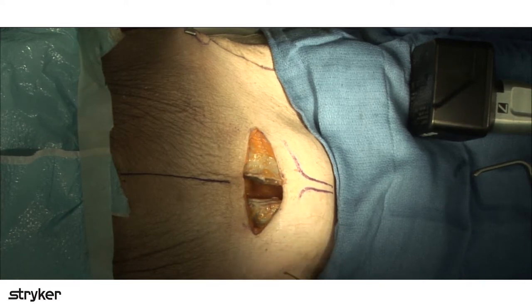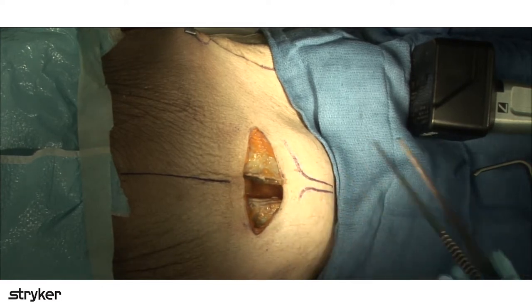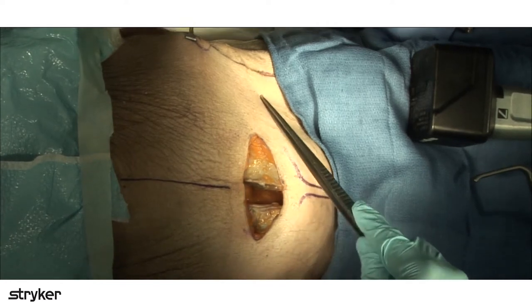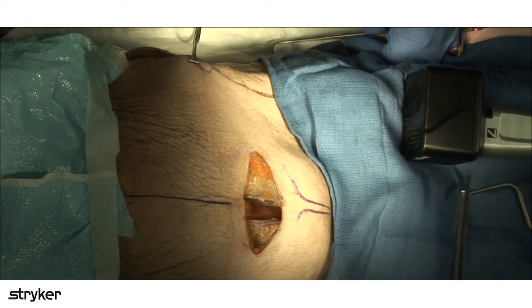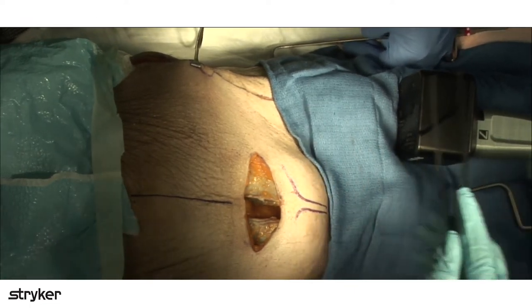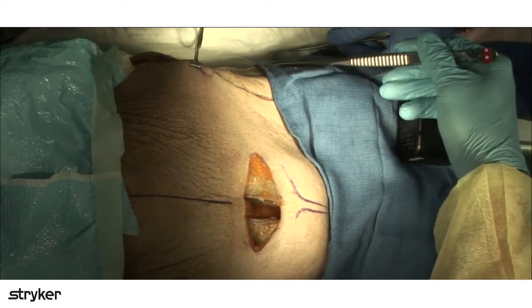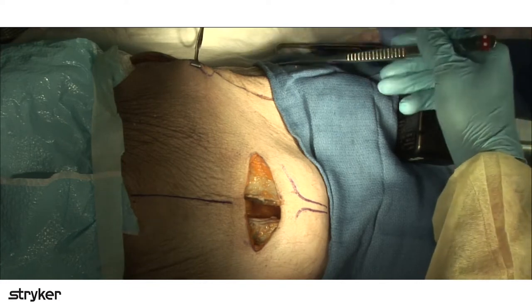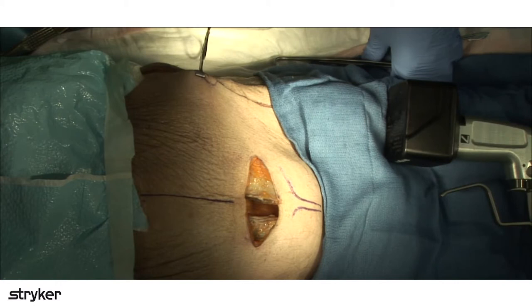When we're doing the AIP here, the first thing is, we talked about it earlier, you make sure that you have the ipsilateral hip flexed. So I put it over a padded triangle or something like that, and I get it up fairly high, maybe about 30, 40 degrees of hip flexion. And then lateral traction through the greater trochanter, coming out laterally and distally, along the trajectory or the vector of the femoral neck.